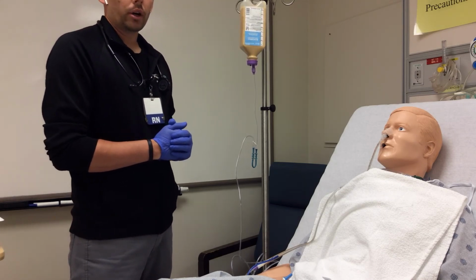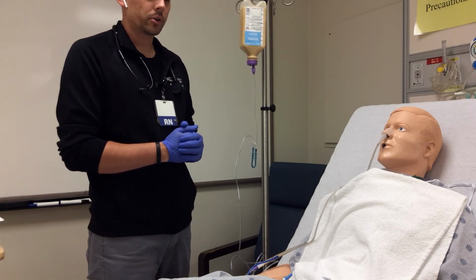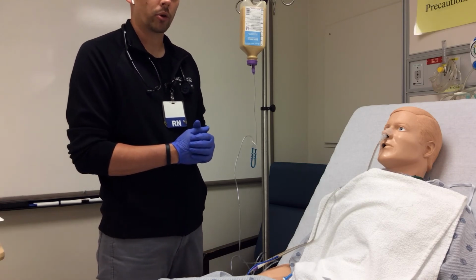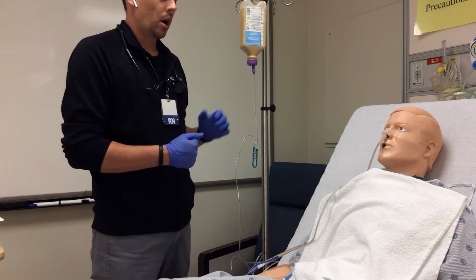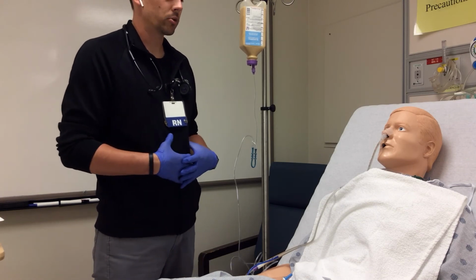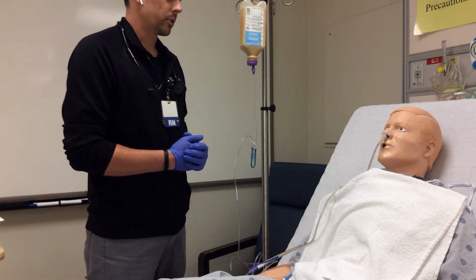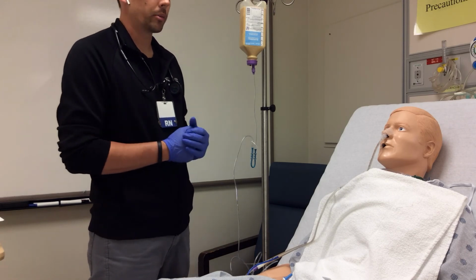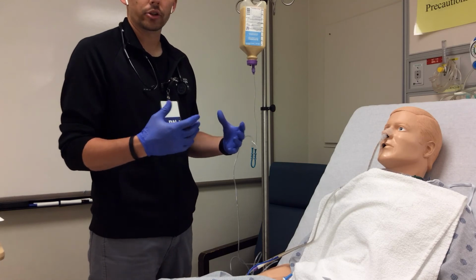With continuous tube feeding, we are making sure we're doing our focused assessment, our nasogastric tube assessment, every 4 hours. And while doing so, we are also checking gastric residual volume every 4 hours as well. And that becomes even more important with a continuous tube feed because we want to make sure our patient's tolerating the rate okay. They're not developing any gastrointestinal symptoms, they're not having any excessive loose stools, and they're tolerating it at the rate that it has been prescribed. So by checking that gastric residual volume every 4 hours, we can make sure we're not over distending their stomachs.